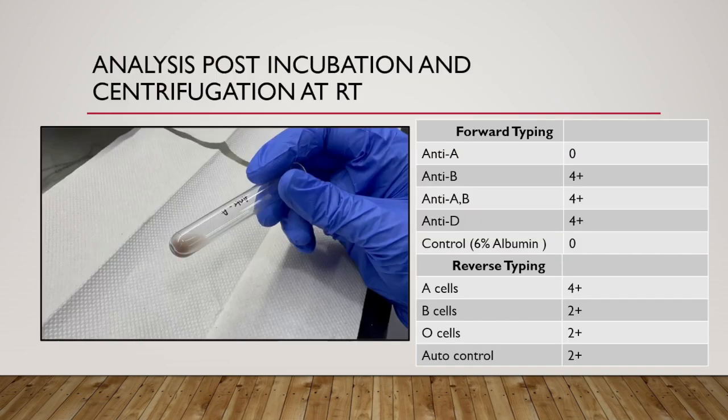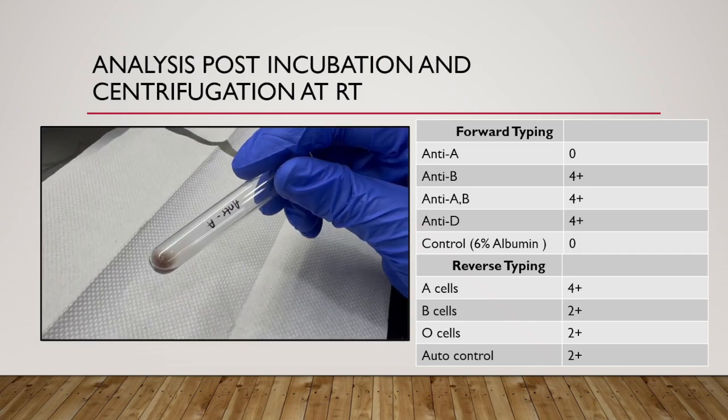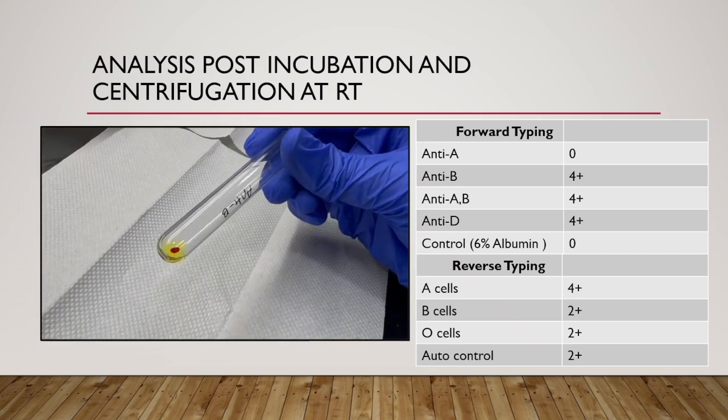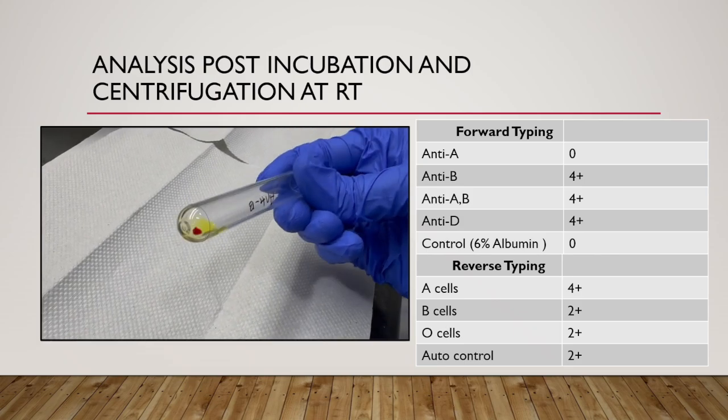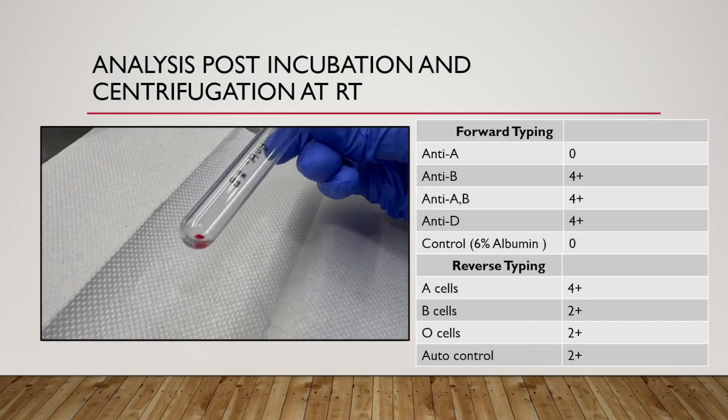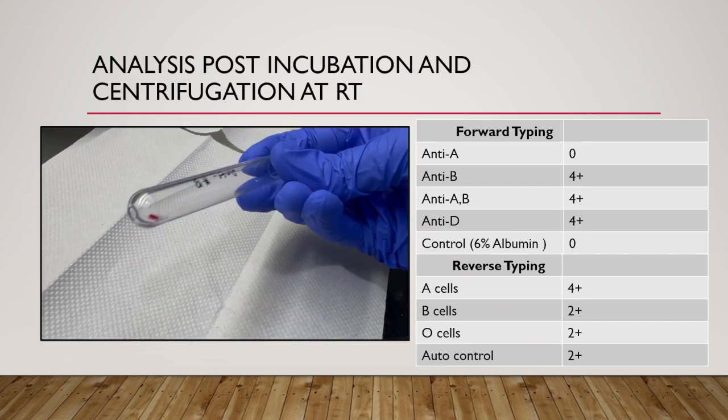Now we will be proceeding with the testing initially at room temperature, as we have mentioned before. We have mixed the contents in the respective tubes, and we have kept it for incubation for 15 to 30 minutes, followed by centrifugation also. And now we will be analyzing the results we have obtained. Here we can see that in forward grouping, in the tube of anti-A, there is no reaction. In anti-B, there is a clear-cut 4 plus agglutination reaction. In the tube of anti-AB also, there is a 4 plus agglutination reaction.